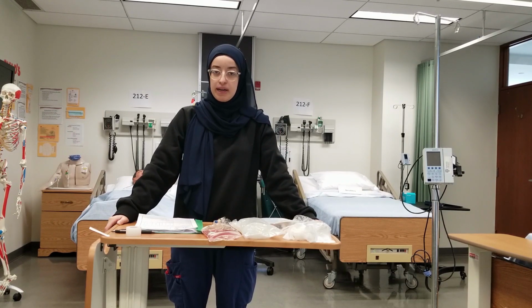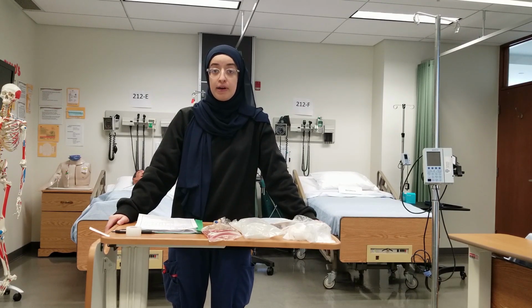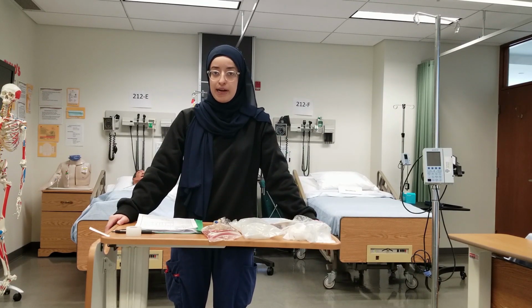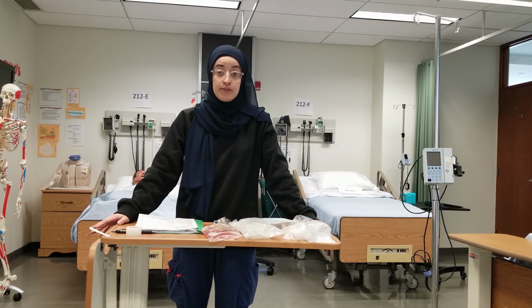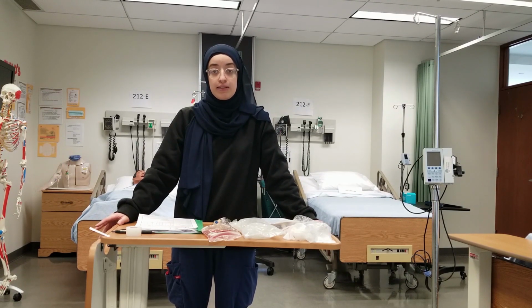I'm a fourth year peer mentor in the general lab, and today we're going to go over the Blood Products Administration CPE. There are many reasons why you might be giving blood products to a patient, and many different types of blood products you might give. There's packed red blood cells, fresh frozen plasma, platelets, and each different type will have a different reason as to why you give it. So consider your patient's diagnosis relative to whatever you're going to be giving to the patient.